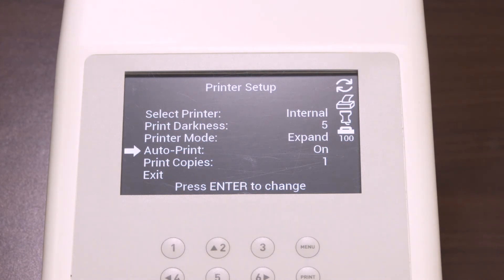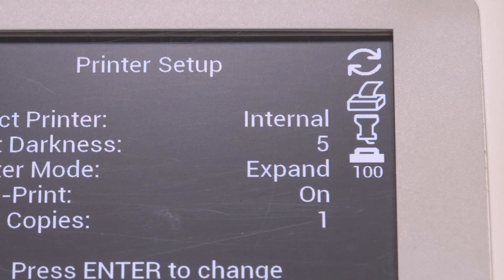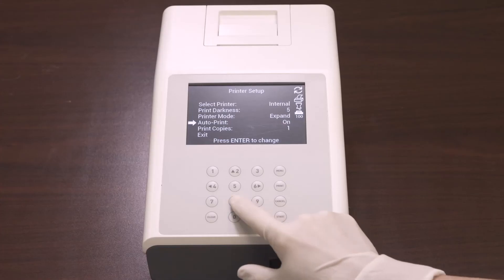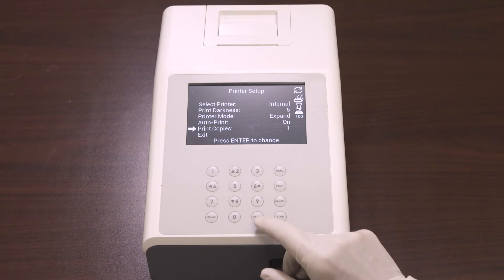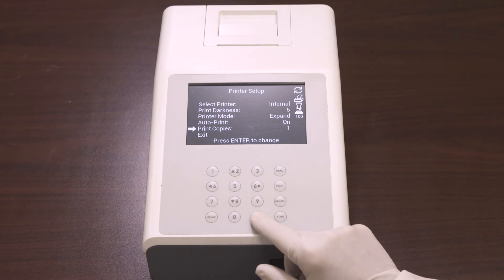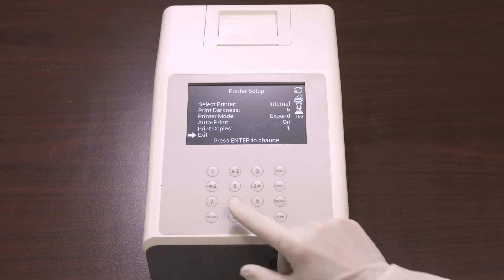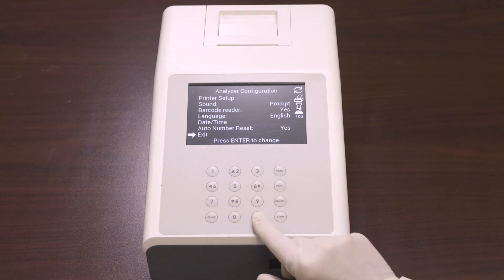Next is auto print. Selecting on prints the results after each test and the printer icon is displayed. Selecting off requires pressing the print key to print the results, and the printer icon is not displayed. Last is print copies, which defines the number of test result copies printed at one time. It can be set from 1 to 3. Once you've finished your selections for the printer setup, select exit and press enter to return to the main menu.